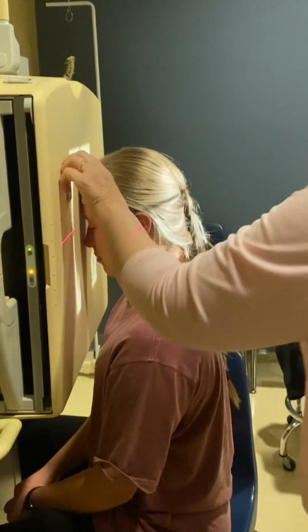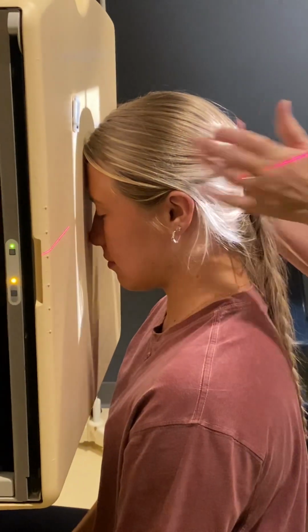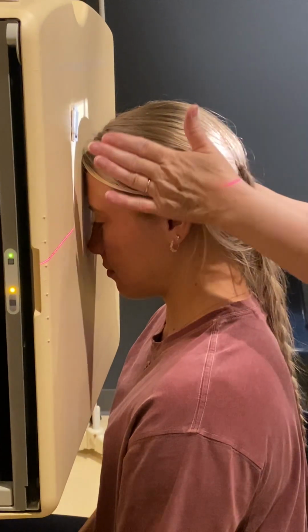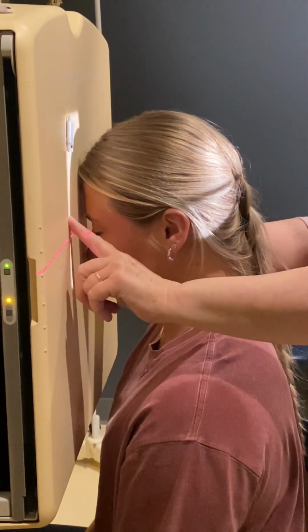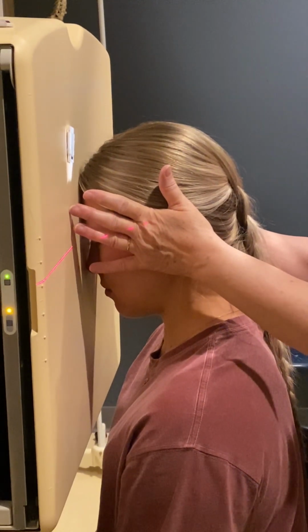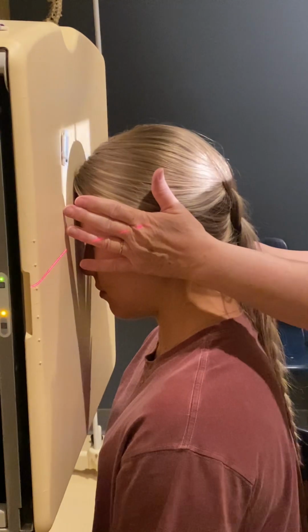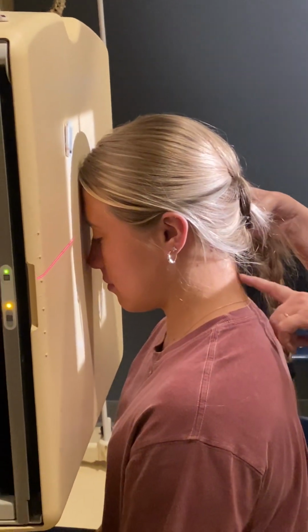All right, marker on. Now, rotation, you've got to look at the top of the head down. You've got to look at equal line on both sides. And you have to feel for rotation. I'm going to move you over just slightly. And I often look at the neck to make sure I'm mid-sag as well.